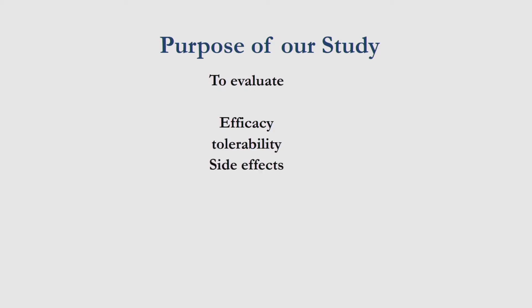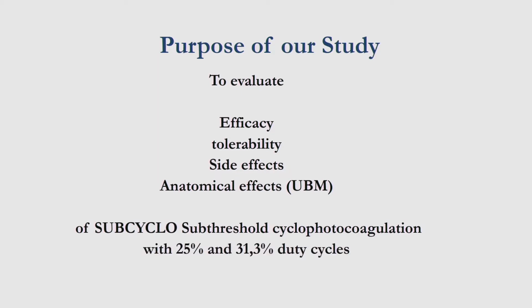So I'm going to tell you about our studies. We have two studies, with the aim of evaluating the efficacy, the tolerability, the side effects, and the anatomical effect with UBM, using SubCyclo with a duty cycle of 25% in the first study, and 31.3% in the second study.